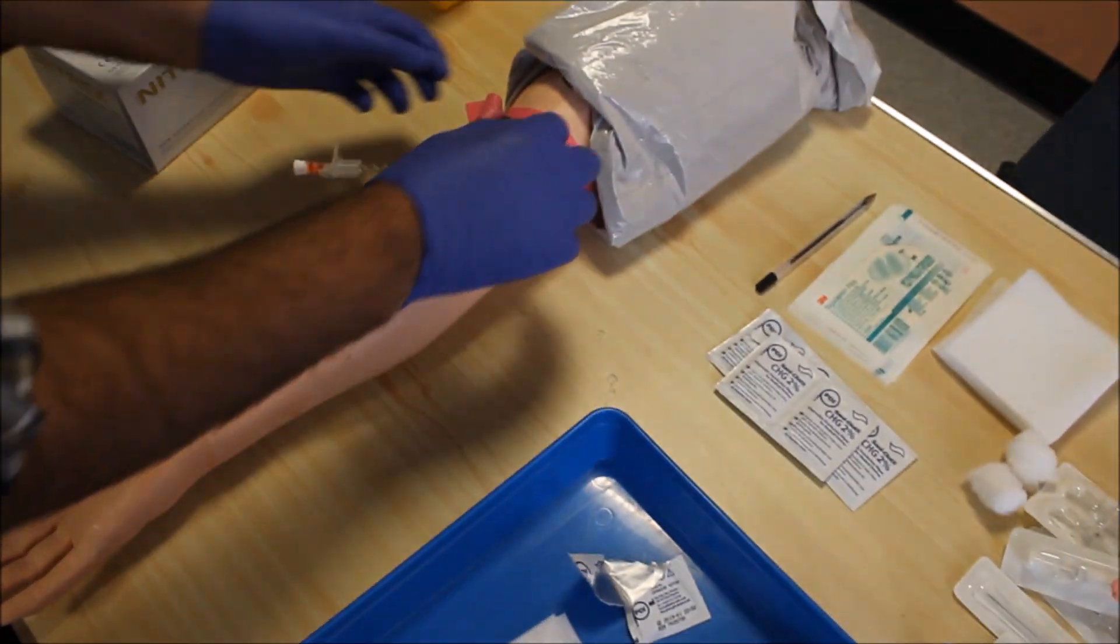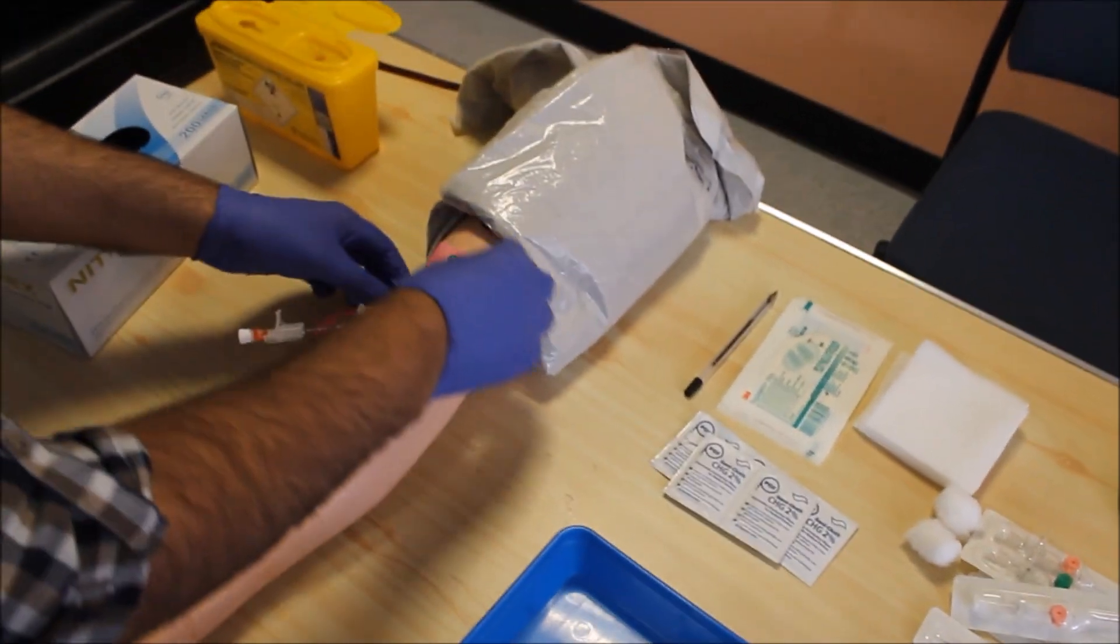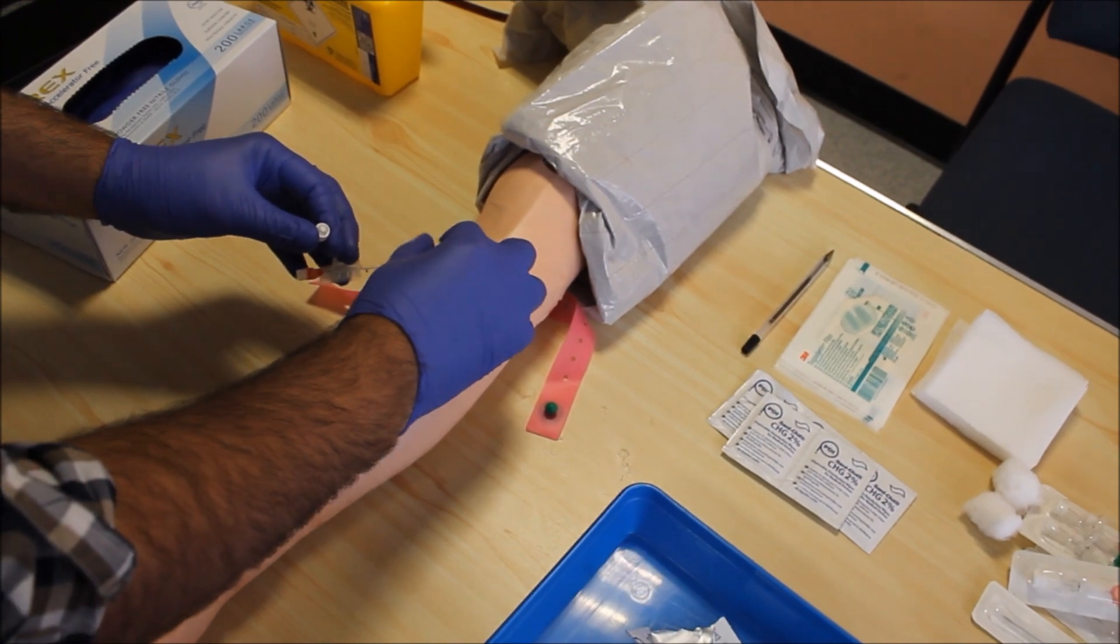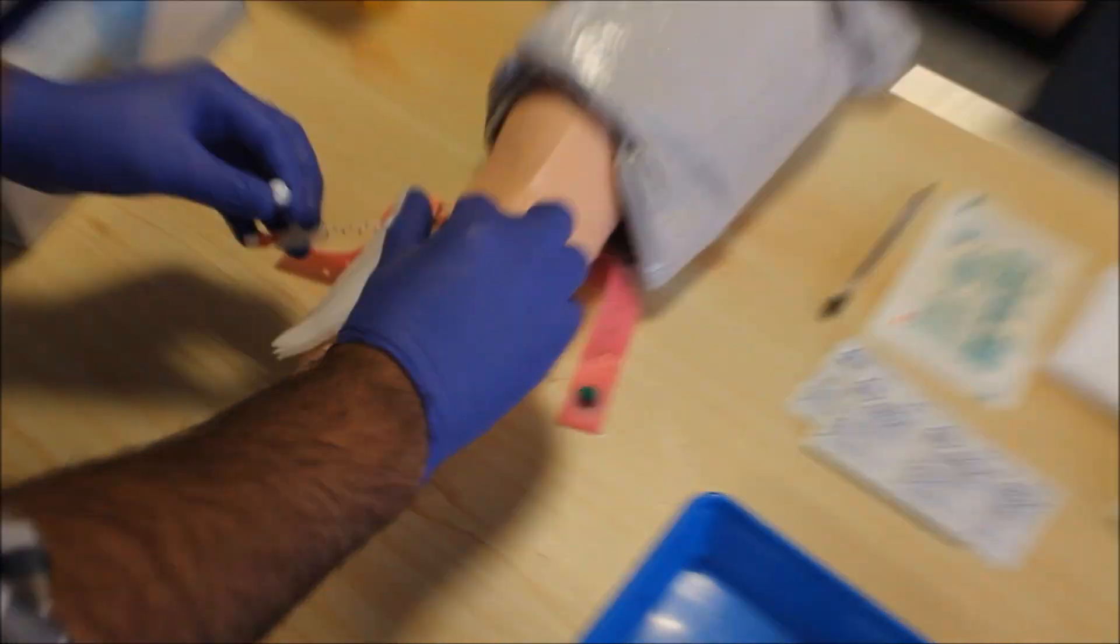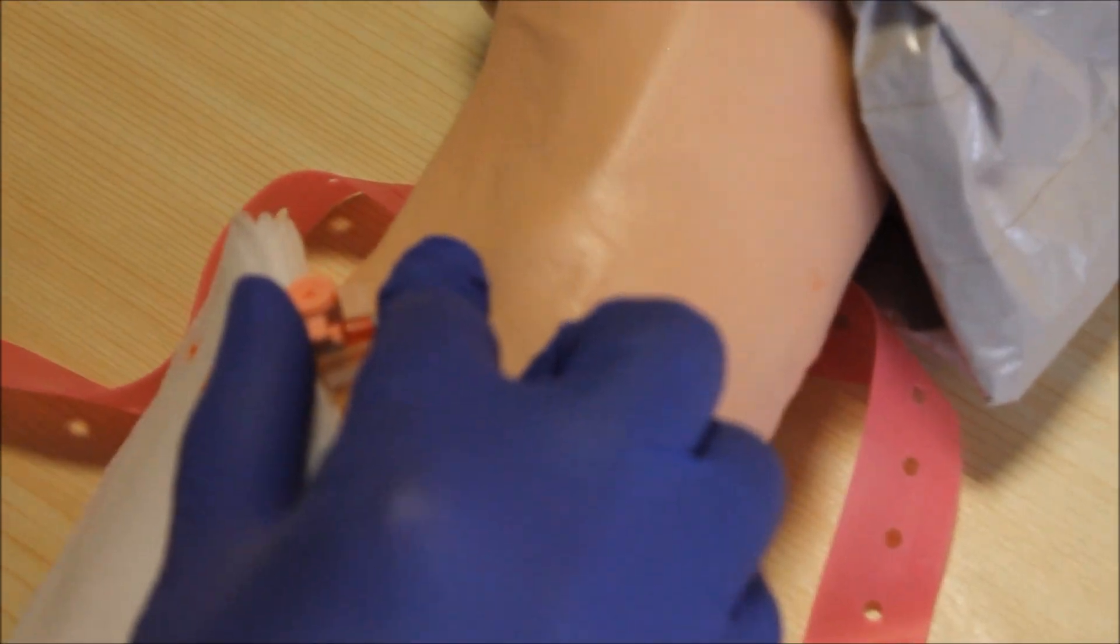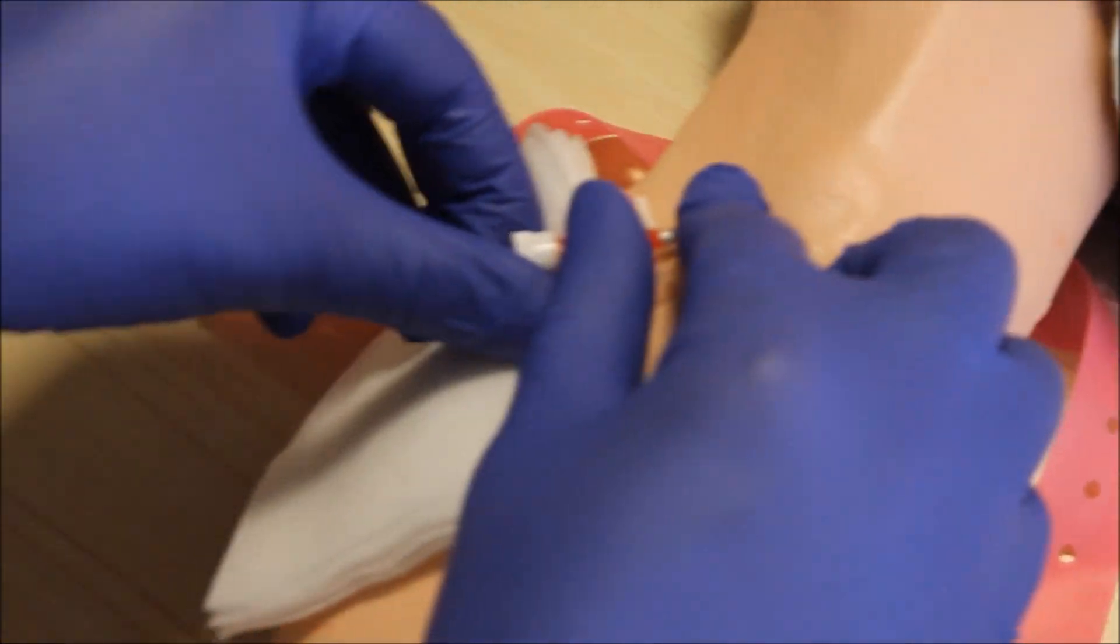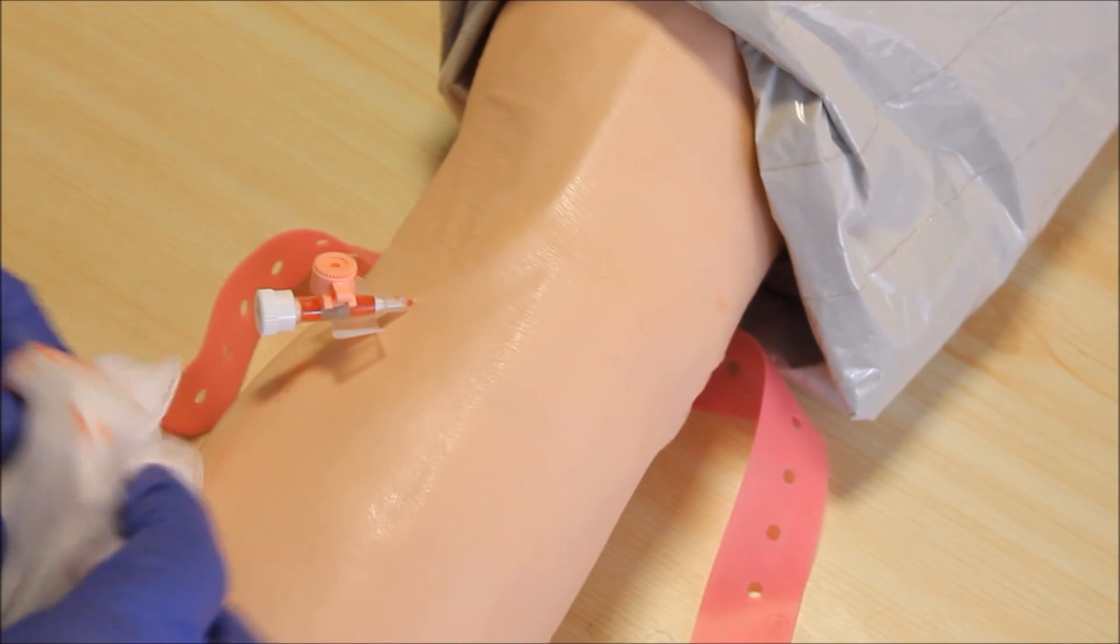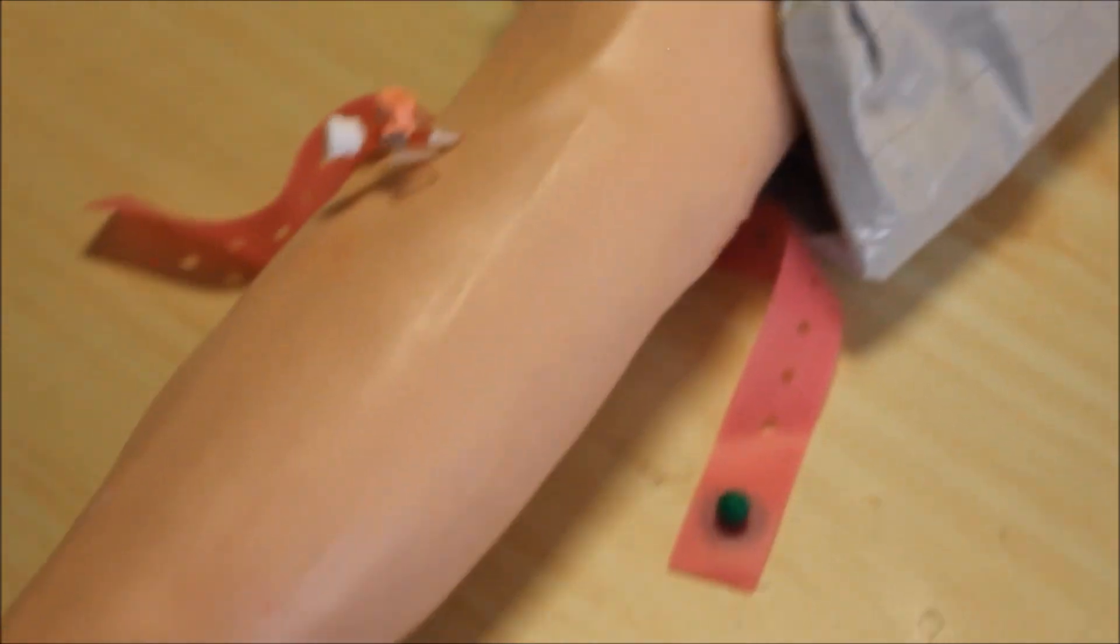After that, you need to remove the tourniquet and remove this. Put your hand over here so that the patient doesn't bleed too much. Throw this away, cap the cannula, and ask the patient to keep very stable.